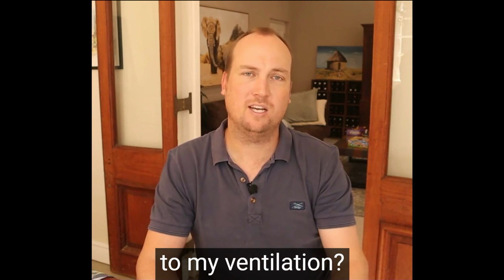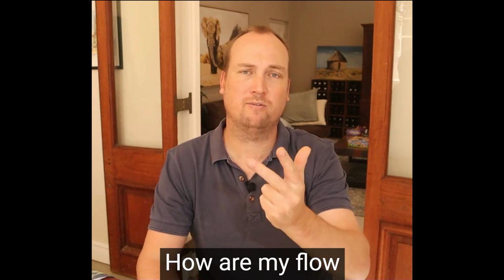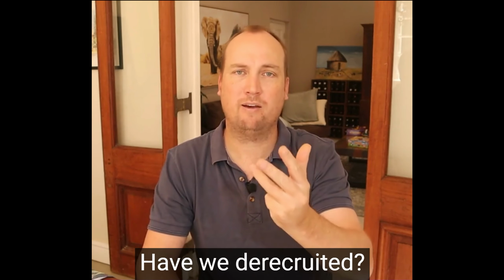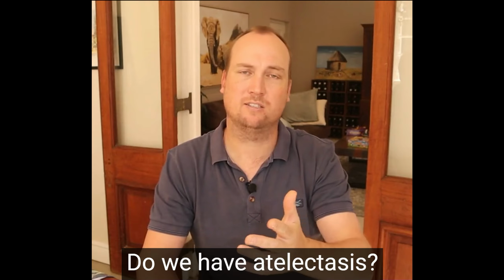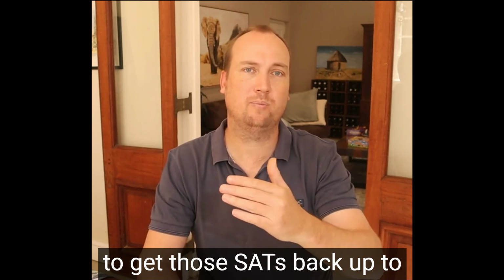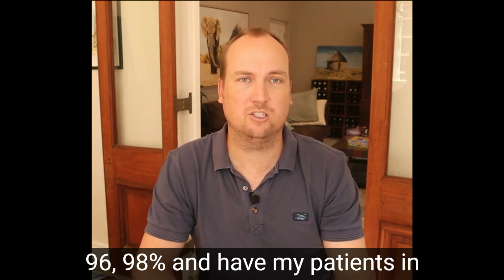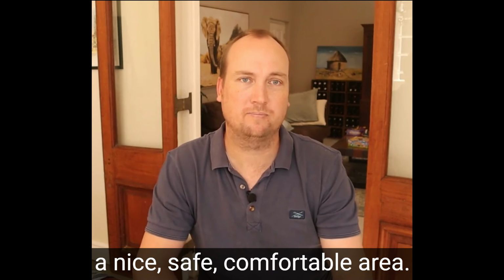What's happened to my ventilation? What's happened to my inspired oxygen concentration? How are my flow volume loops looking? Have we de-recruited? Do we have atelectasis? Are there secretions? I want to intervene and I want to get those SATs back up to 96, 98% and have my patient in a nice, safe, comfortable area.